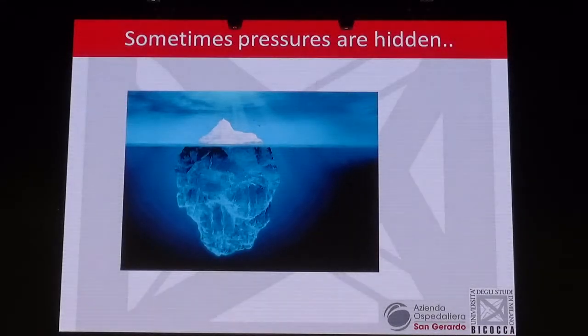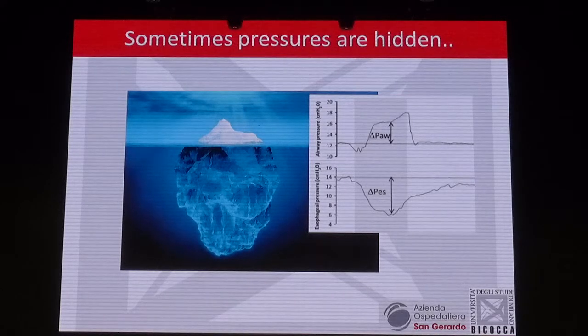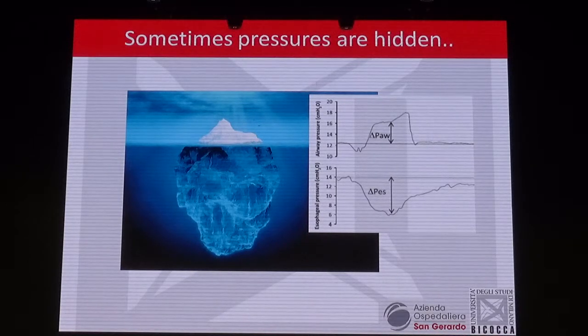And I think esophageal pressure is important. Again, I've shown this slide yesterday, because pressures during spontaneous breathing are hidden. It's like an iceberg. We see airway pressure, what is outside the water, what is outside the patient. We see the ventilator waveforms, but we do not see the flooded part of the iceberg, what is under the water, inside the patient. And exactly like in an iceberg, this is dangerous because we don't see it, and because it can be much larger than the part that we see.